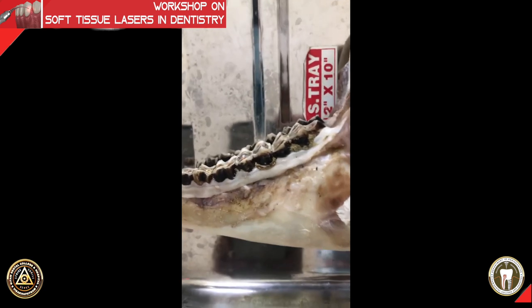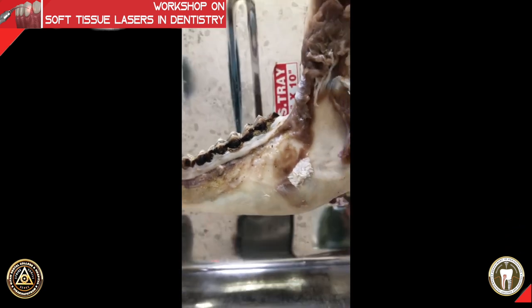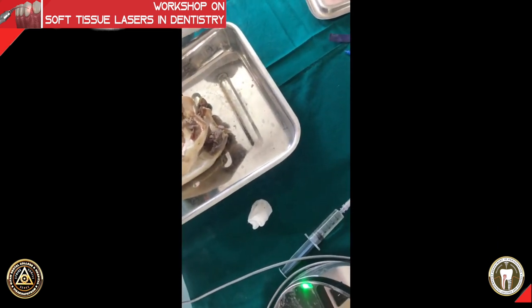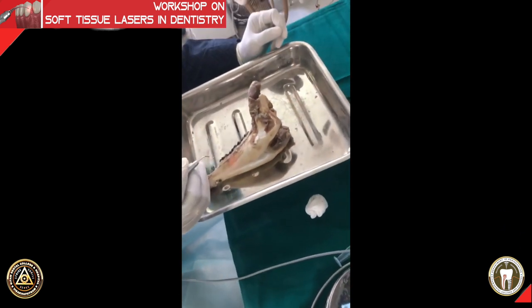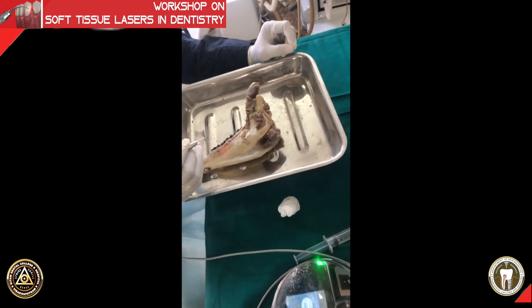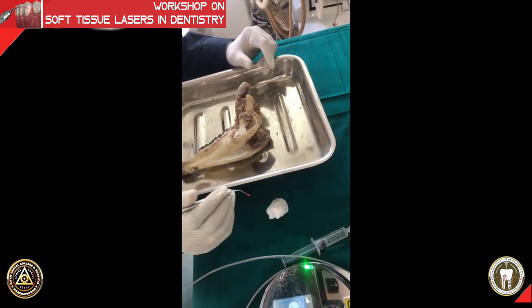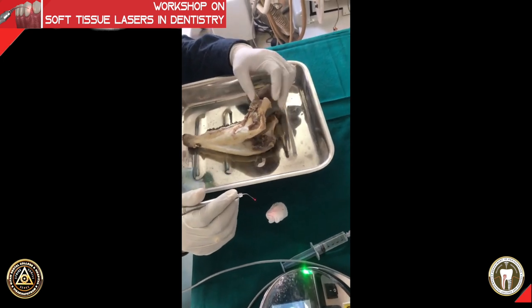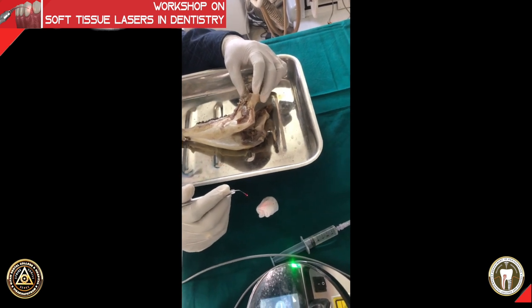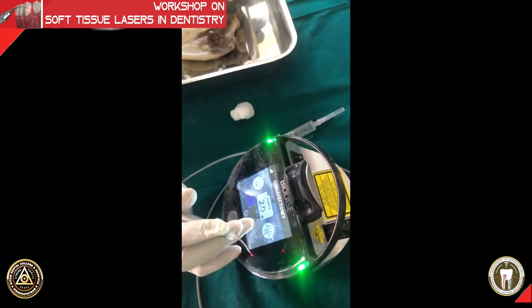Before you do a gingivectomy, make sure it is indicated. Your restoration or caries margin should not be close to the bone, and you should not be violating the biologic width. Periodontists understand this, but many practitioners find it difficult. You cannot do a gingivectomy for every procedure — if you want to do every procedure with gingivectomy, buy a 35 lakh erbium machine that allows gingivectomy with closed flap ostectomy.